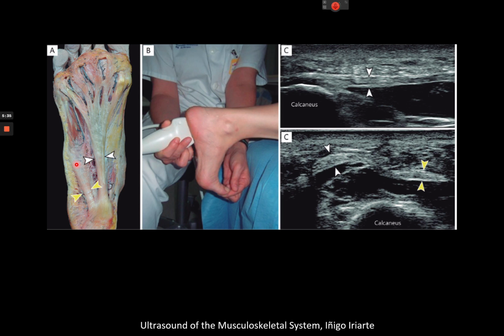Yeah, they'll appear pretty similar, but when they do a scan, typically in radiology, they often won't scan that underside. They'll look at the tendon. They'll look at brevis. So you can get a scan come back and you go, this is really odd. This patient's really painful. They're having trouble weight bearing, and the scans come back saying peroneus brevis is intact, unremarkable. It's typically underneath.